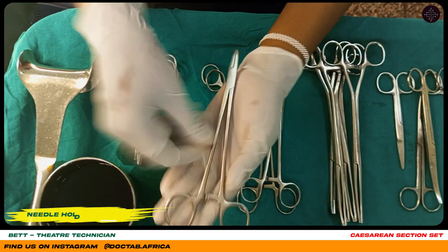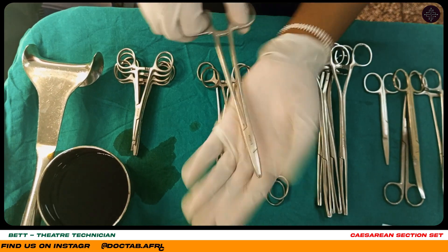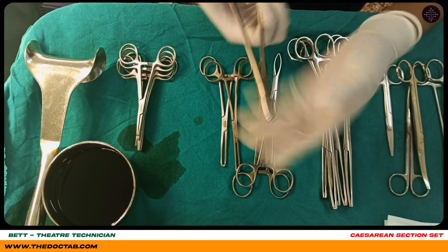Here we have our needle holder. This is where we hold the sutures. We put the suture here — it holds the suture when suturing.